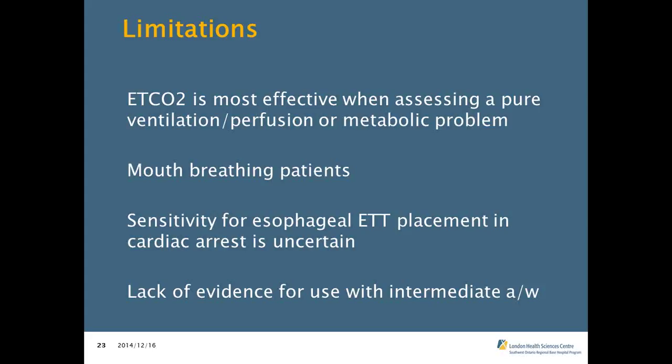If you're noticing you're getting a flat waveform, then that should, again, looking at your patient, prompt you to ask what else is going on. They have a pulse, okay, well, this is an issue with the tube, and maybe the tube may have slipped and is now no longer in the trachea.